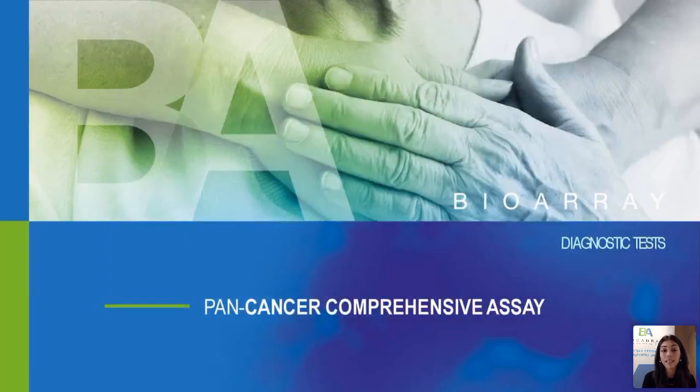The next test is the Pan-Cancer Comprehensive Assay, which is kind of a little sibling of the previous one. I say this because in some sense it's similar: it's a test that has been designed to perform a screening for whatever kind of solid tumor independently of the tissue of origin. So with one test, you will be able to assay almost whatever solid tumor you might be interested in and make a genetic screening.